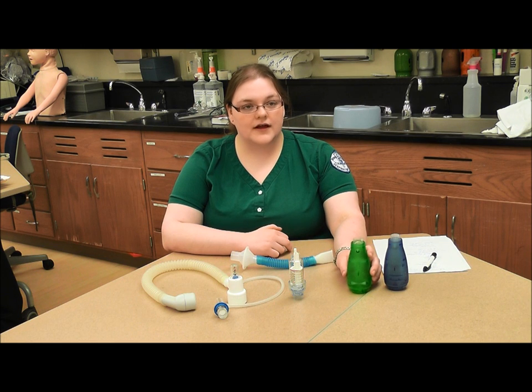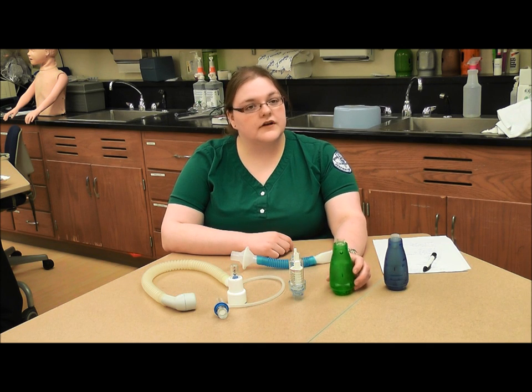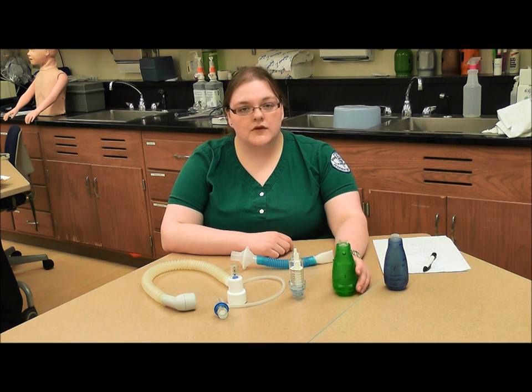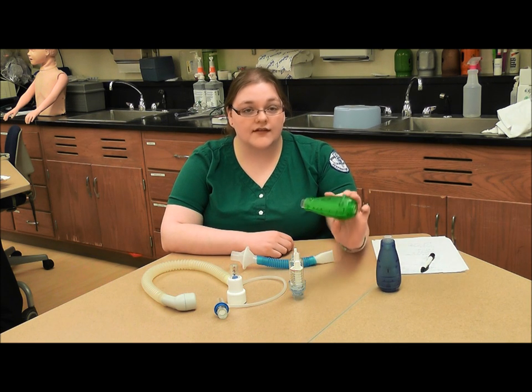Here we have two different acapella devices. They are modernized versions of the flutter valve. The green one is intended for people with normal lung function, and the blue one is indicated for people with COPD. Sometimes in the hospital, you'll hear the workers, or maybe even the patients, refer to these as pickles.